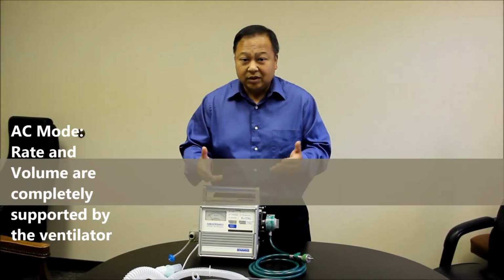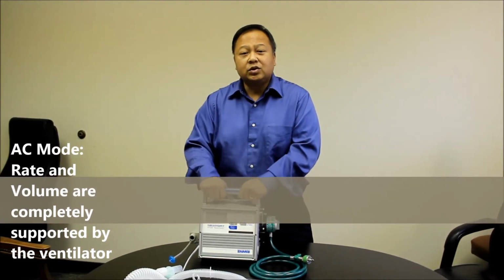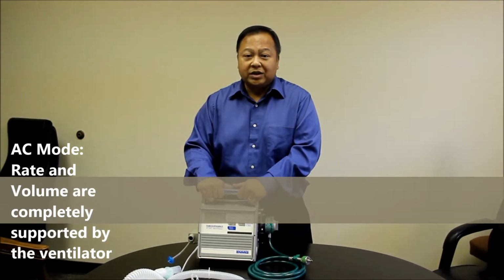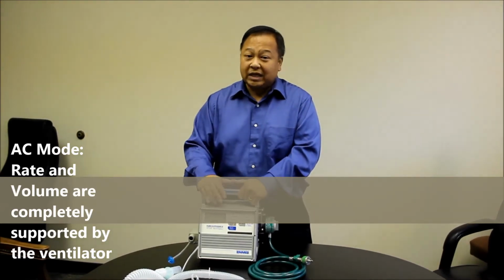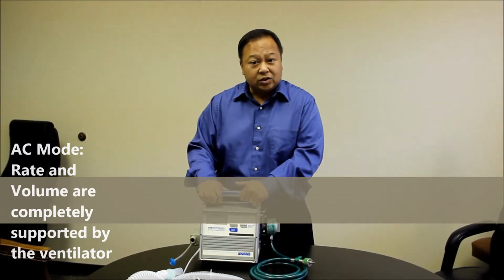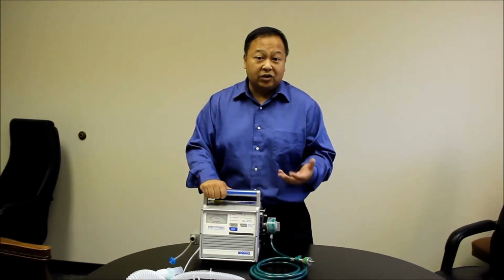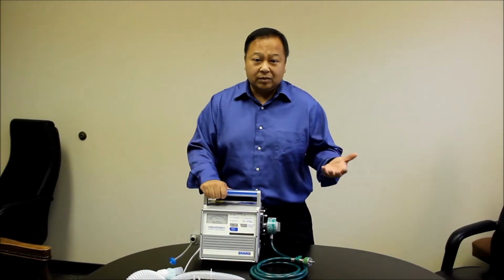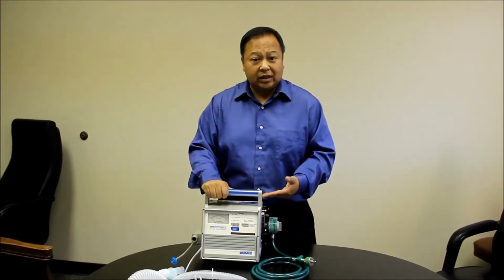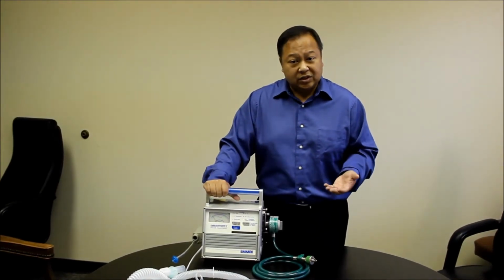Just to give you a bit of information about assist control: it's where the ventilator does all the breathing. When a patient is on assist control, most likely they're pretty much out, either sedated or not breathing on their own. We put a patient on assist control so that we can manage the volumes and the rates that they're getting. Once we do this, we do blood gases to see if we are ventilating and oxygenating them correctly. So that's the first thing, assist control mode.